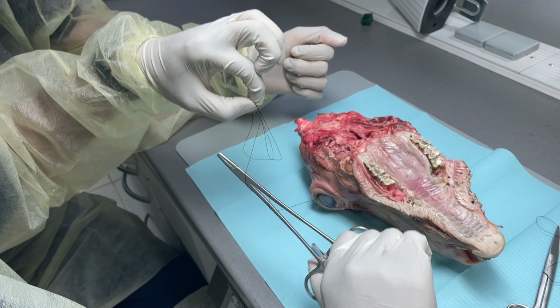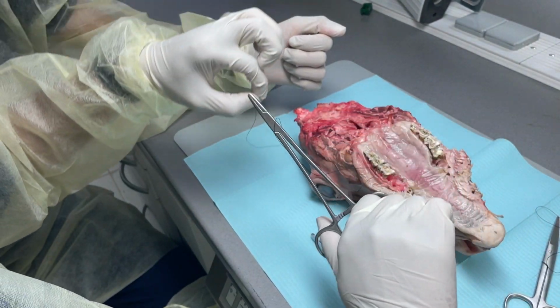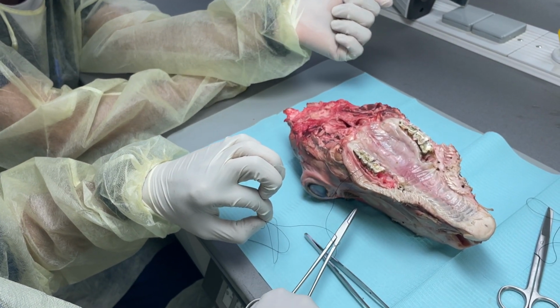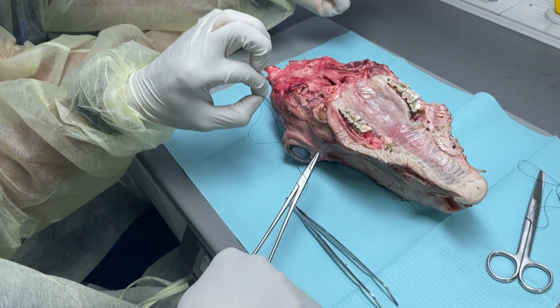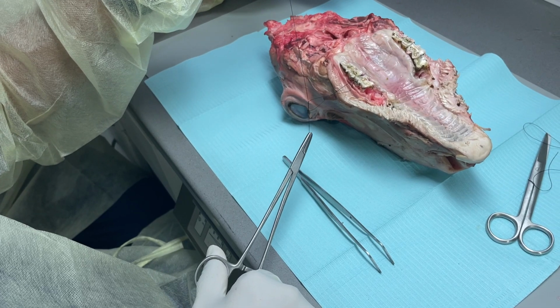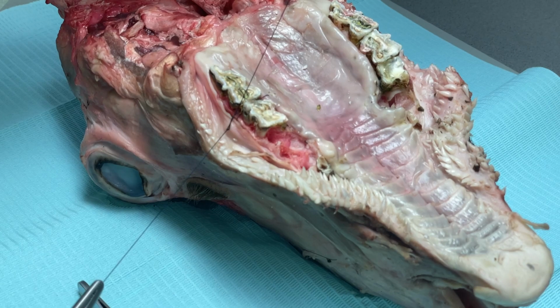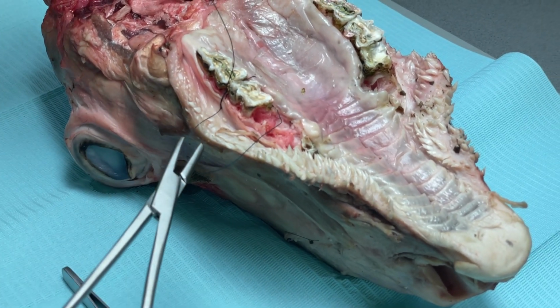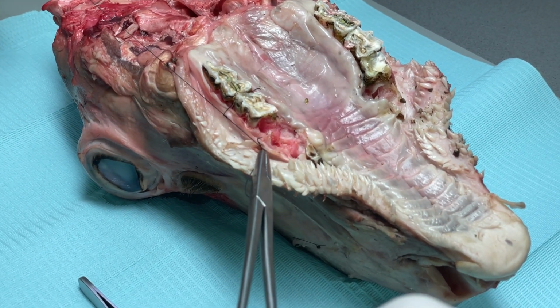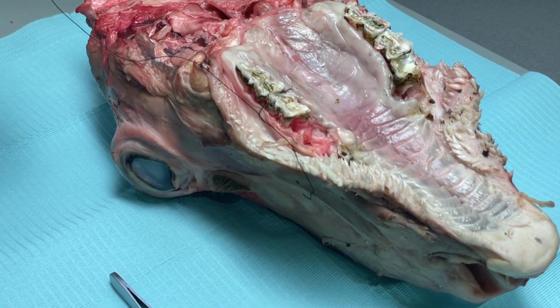Two clockwise. You saw my turns? One, two. Then I will hold this and I will pass it in. This is the knot now. I am passing and I will tie the knot. You cut it from here, right? Yes, cutting is here, on the side. So that was two clockwise.